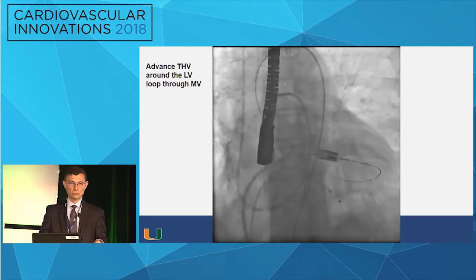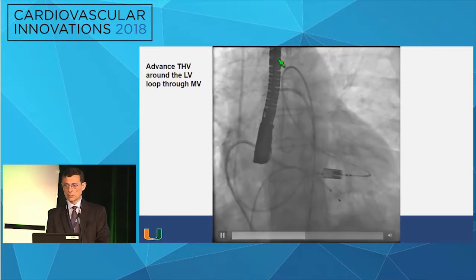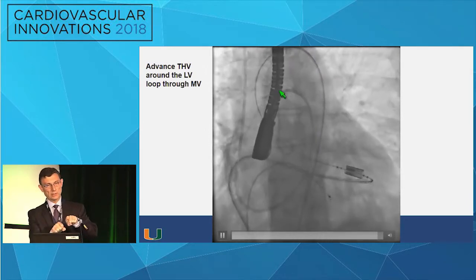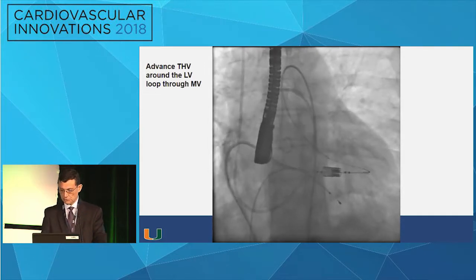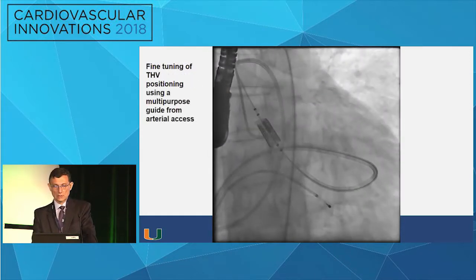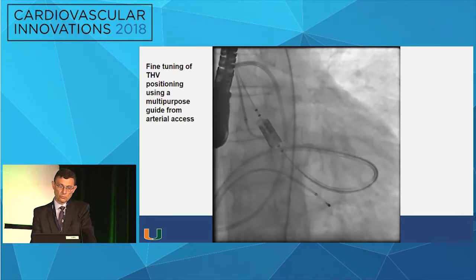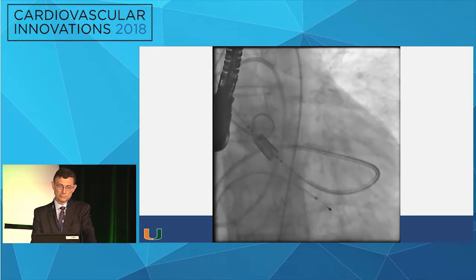So two people have to be in control, one on each side of the patient. And here, as you can see, there is a catheter that will stop the transcatheter heart valve balloon delivery system and prevent it from just, like a watermelon seed, shooting forward into the aorta. So this is a critical part here, measuring that we are at the right place with the valve, trying to be as coaxial as you can. You have control from both sides.